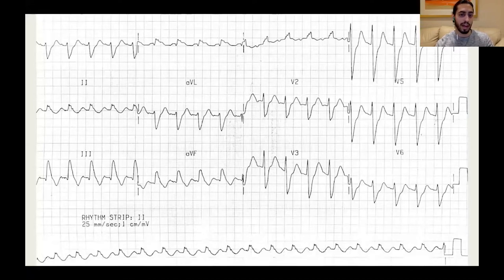It's not something that we haven't done. Always look at the ECG systematically. And then add up the signs, and you may be able to get a diagnosis.